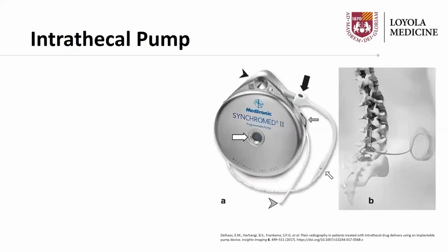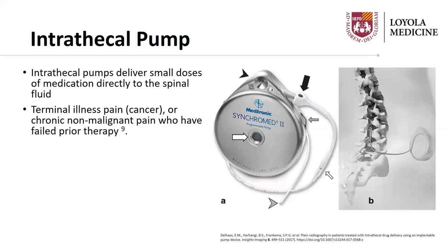All right, so moving on to intrathecal pumps. Intrathecal drug pumps are a treatment option seen in patients with terminal cancer pain or chronic pain that has failed prior therapy. And these pumps tend to deliver small doses of medication directly into the spinal fluid.